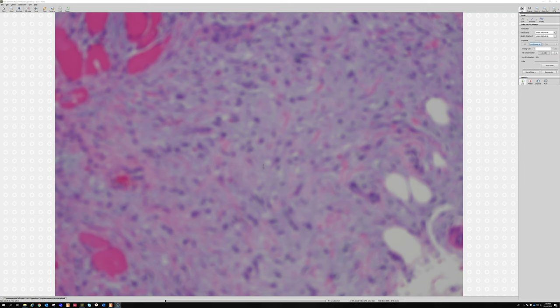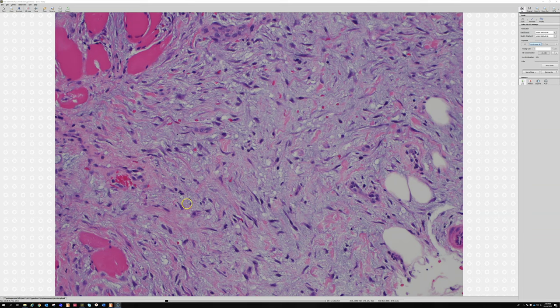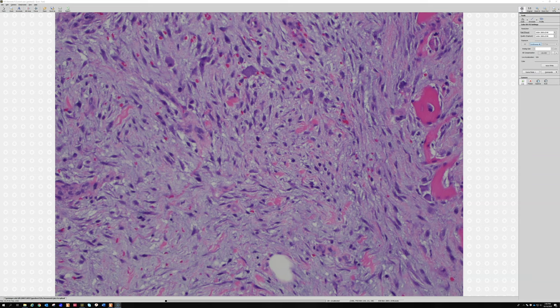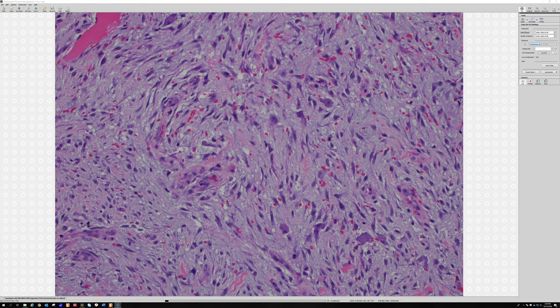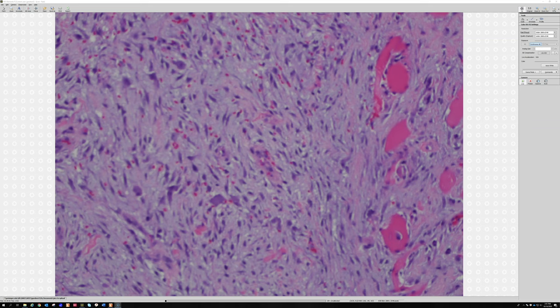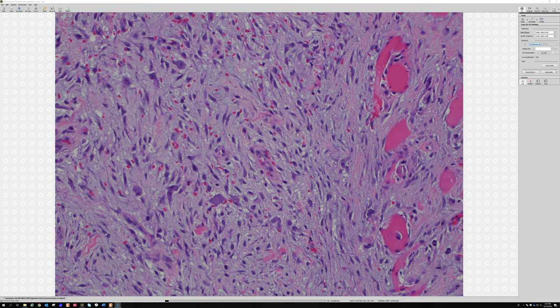What about these other cells — what do they look like? This area is kind of loose, a bit hypocellular, with spindly to stellate cells. If you ignore those big huge cells floating around, the background looks myxoid — kind of like nodular fasciitis a little bit, with extravasated red cells. So the background looks like myofibroblasts with purple cytoplasm, spindle to stellate, hypocellular, in a myxoid background with extravasated red cells.